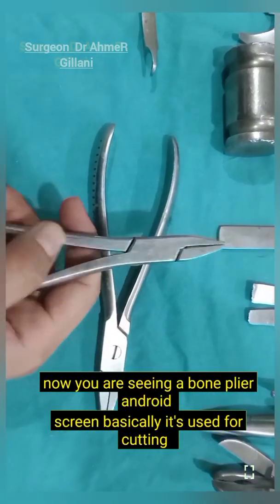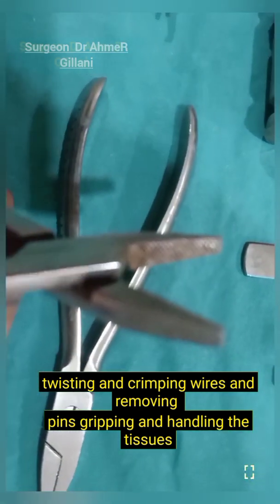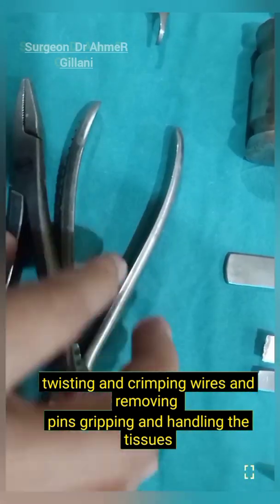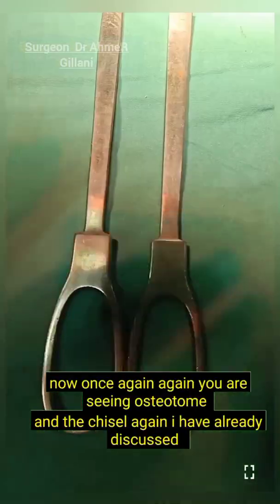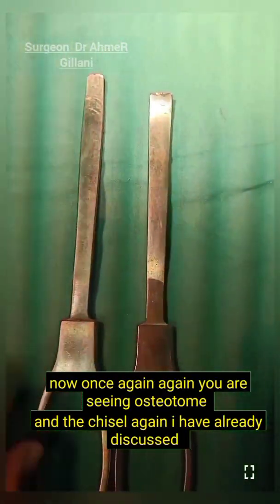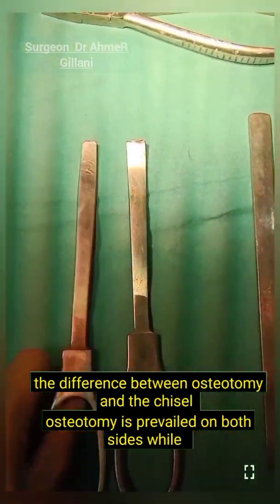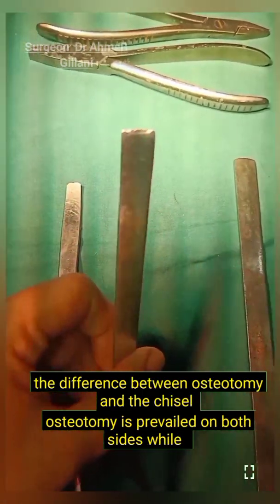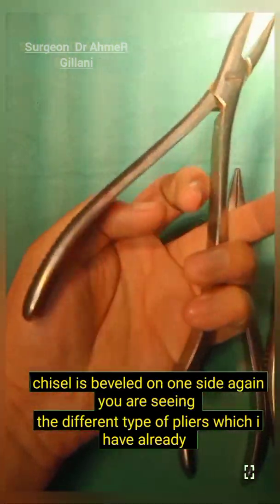Now you are seeing bone pliers on your screen. They are used for cutting, twisting, and crimping wires and removing pins, as well as gripping and handling tissues. Once again you are seeing the osteotome and the chisel. The osteotome is beveled on both sides while the chisel is beveled on one side.